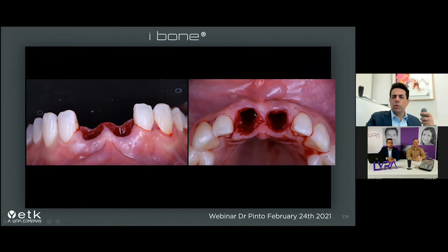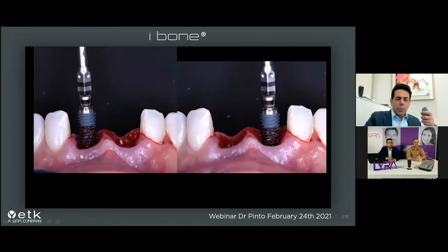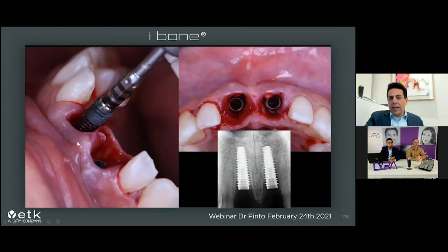When we remove the tooth and present the implant immediately, you see the blood going directly onto the implant. The blood likes this surface. We put the 2 front implants like you see, and obviously we put them a little bit to the palatal side, like we know, in a direction where the screw goes out on the palate, at the level of the cingulum.